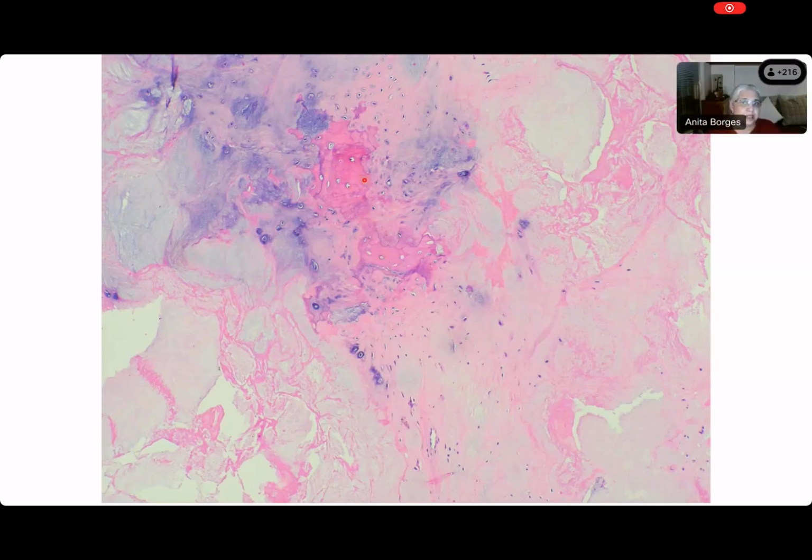You can see the lines that are concentric. So this is old host bone that has been destroyed, and that's what you saw in the X-ray. And you see these grayish, pinkish, floccular deposits. They are a little soft. Soft is something that you feel, but at the same time your eyes can also see a texture. Softness is a texture. So when you see a rock somewhere, you're not feeling the rock, but you know that it is very hard. Similarly here, the texture is soft, and this is the word that you should all be able to use, and that is floccular.